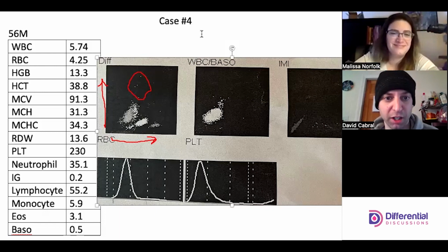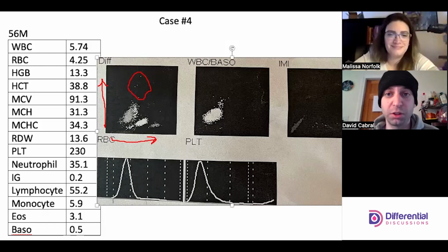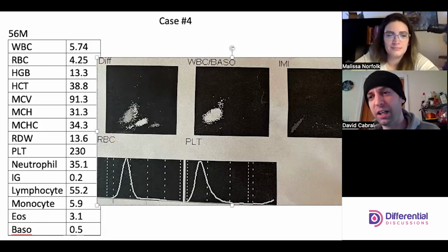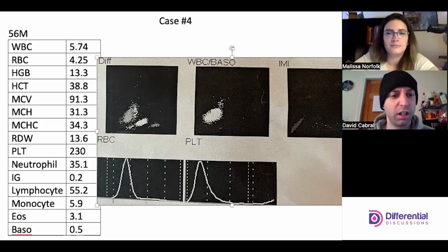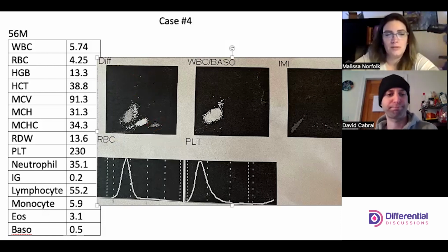So that's usually what they occupy. Although there can be other cells here, right? I mean, lots of leuks and things like that. But there's such small numbers. Just a quick note: if I see a reactive lymph, I'm not going to go crazy. And then just to also note here, it's represented as 3%, right? And so I'm seeing there's a decent amount of EOs there as well. So I'm just going to pay attention to that. But yeah. All right, you ready?